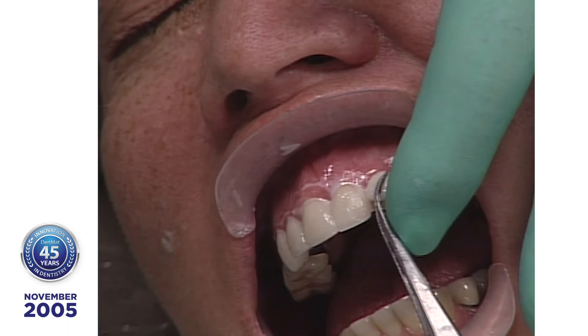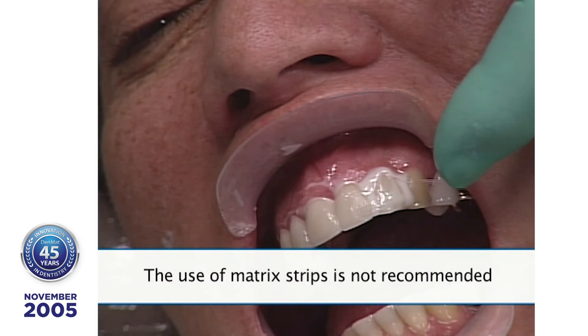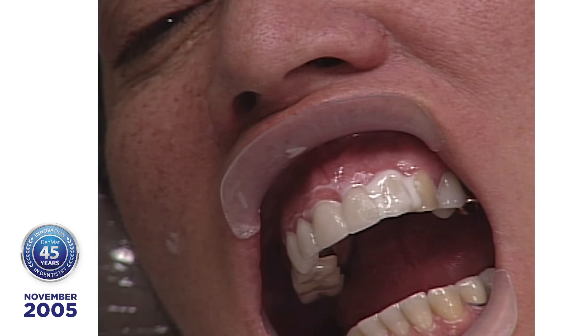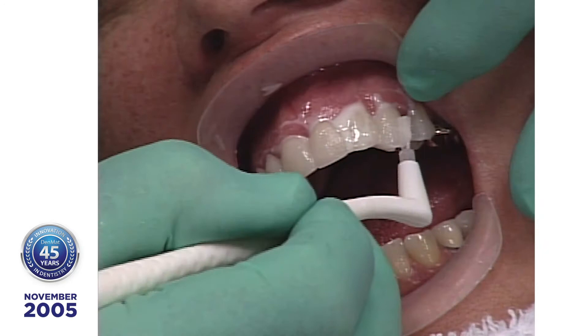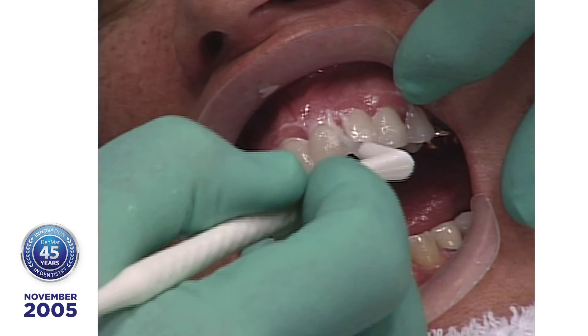I don't use strips because if you add up the thickness of six or eight strips, it gets to be quite a bit and then you don't get the veneer seating. I usually like to do the uppers first, and after we've got the maxillary in, then start solving the problems with the lowers. You can do them together, and many dentists do that very successfully.